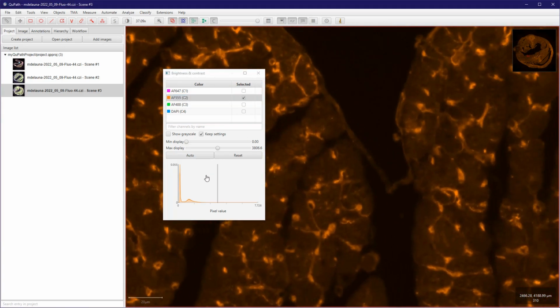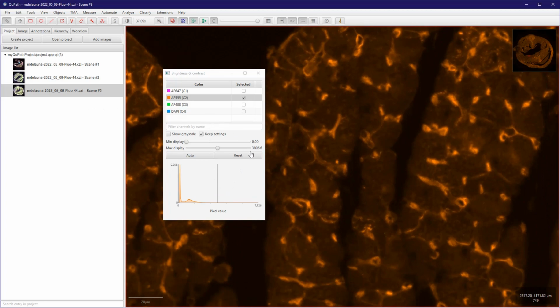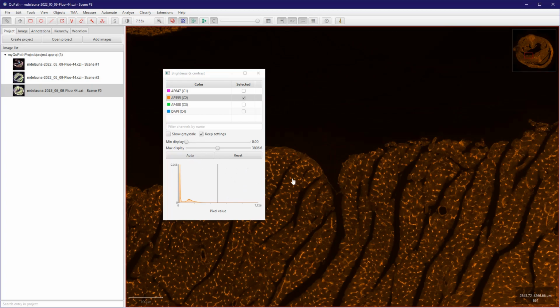So if you want to be a bit thorough, when you do the thresholder, you have to make sure you set up the right value. So for instance here it should be, let's say, something about 500 as a minimum, something like this. We can try it, but this gives you an idea, and this works for the orange channel.